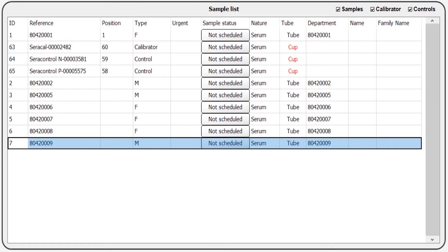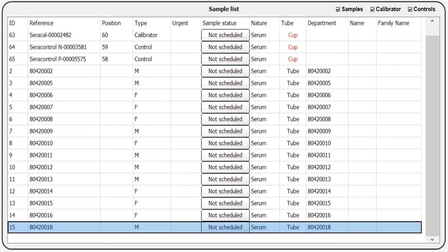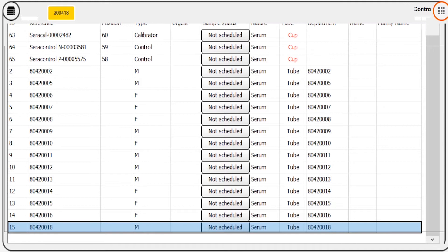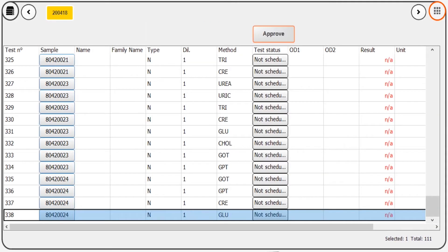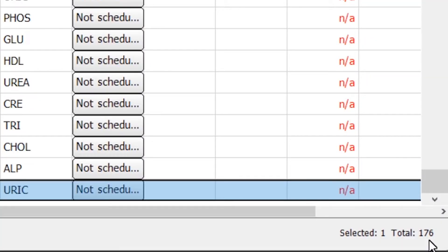Piccolo CHEM can be interfaced with ASTM protocol. Through bidirectional communication, the software receives all the information on samples and tests to be performed from a host computer.